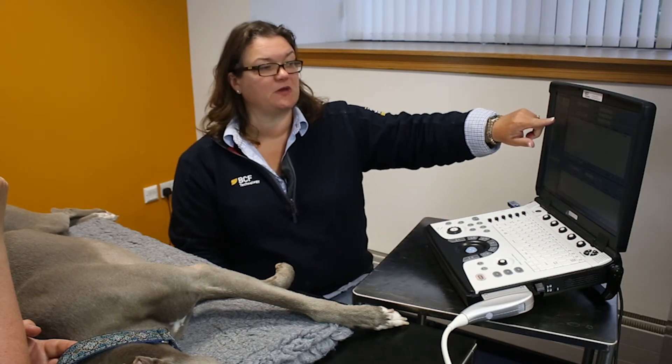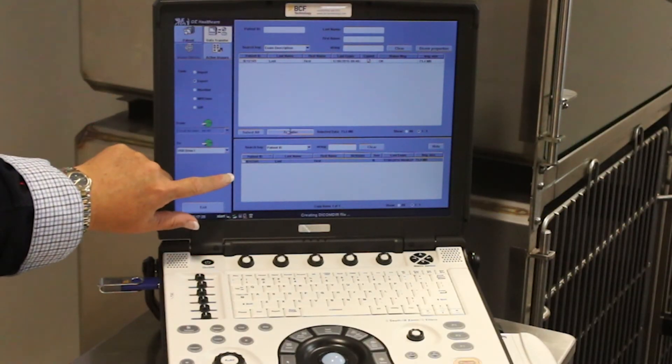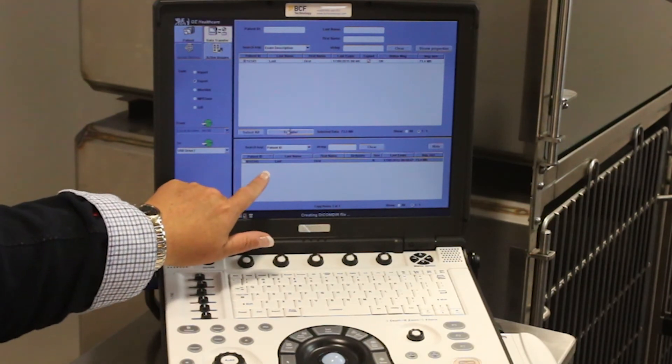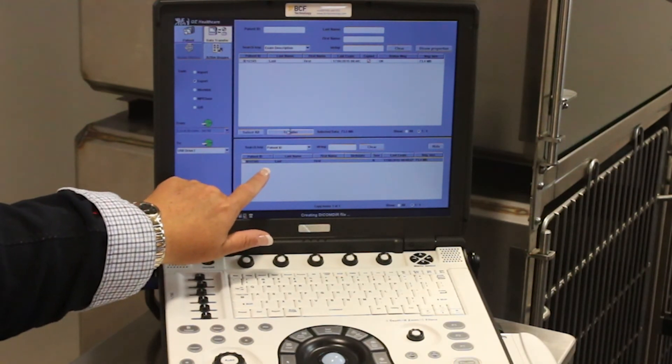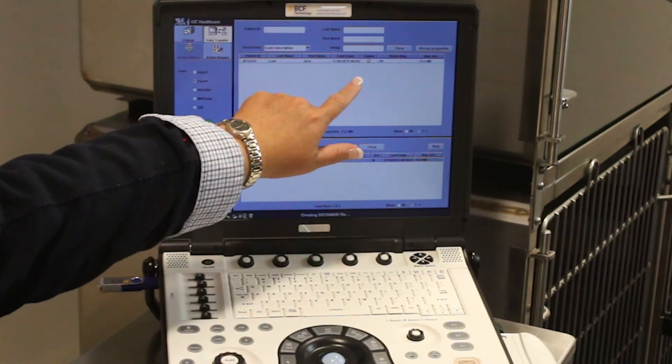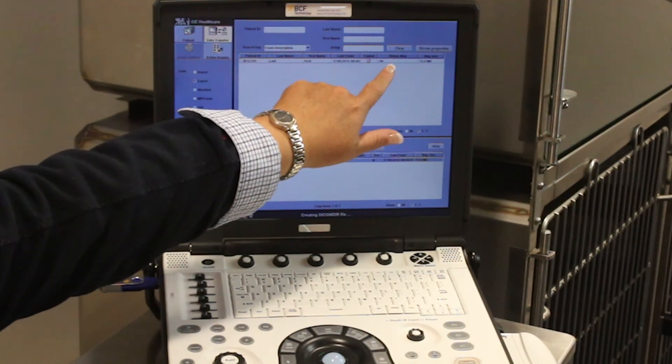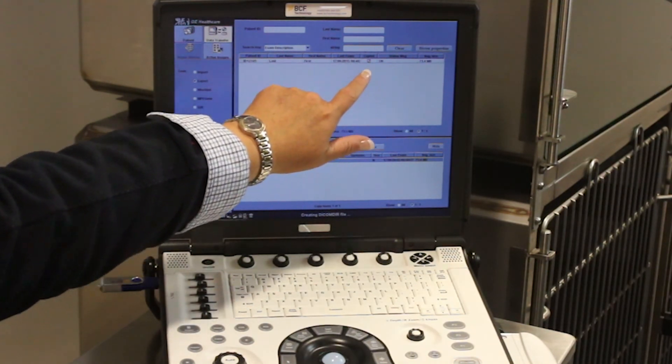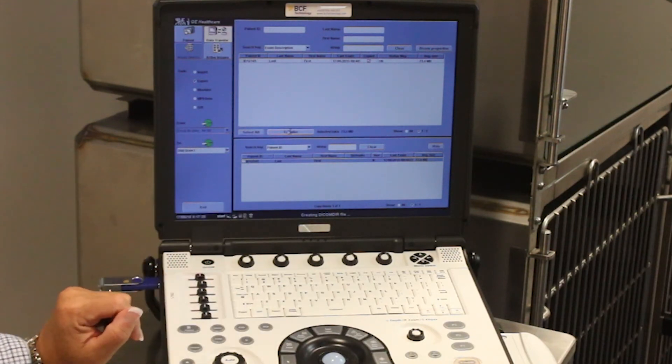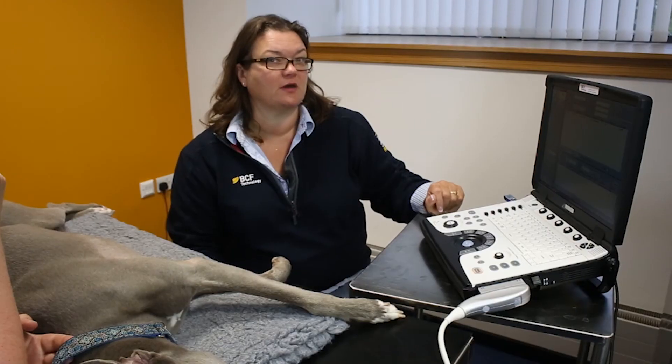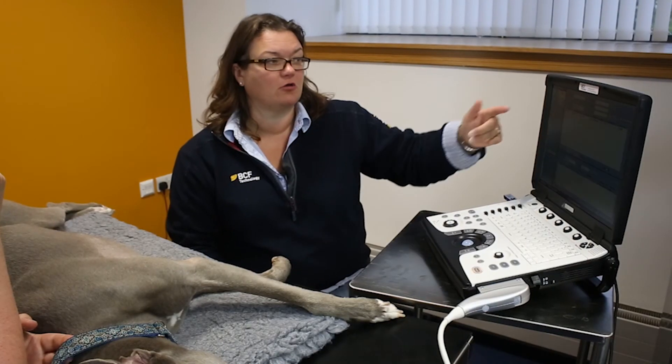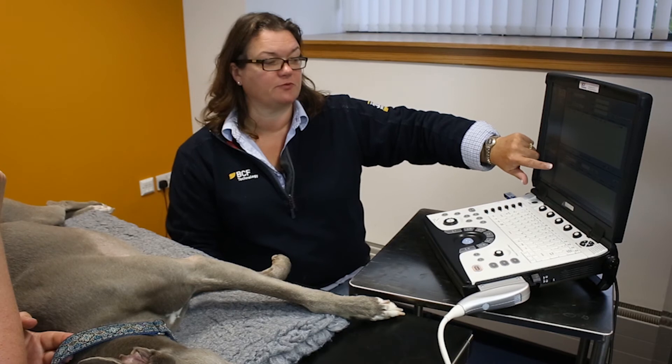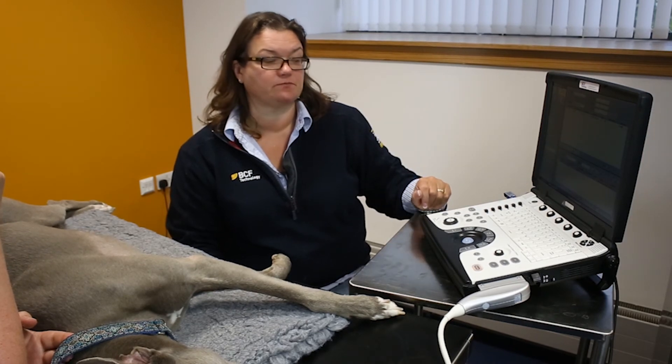Once the patient has been transferred onto the USB drive, you'll be able to see it down here. It appears down here when it's on the USB stick. You'll also see up here that the status message is OK, and you've got a red tick in the copied box. That means that all the information has gone from the hard drive and been copied down onto your USB stick.